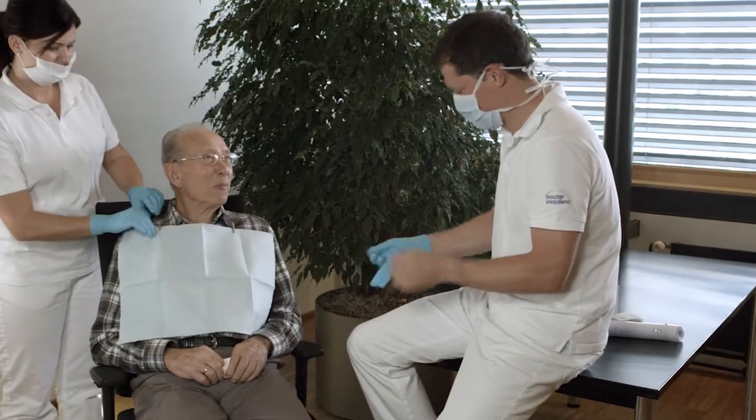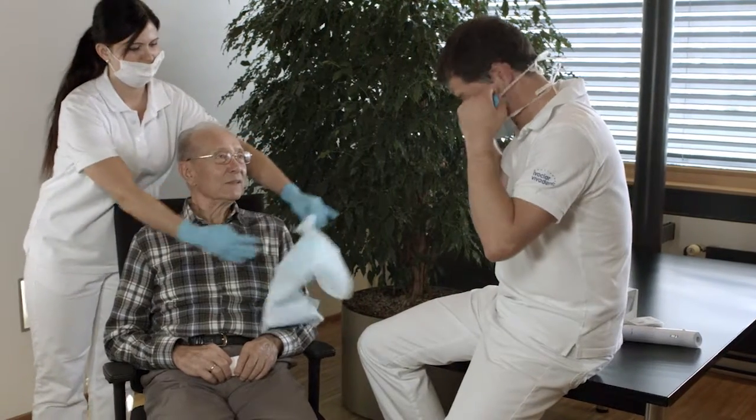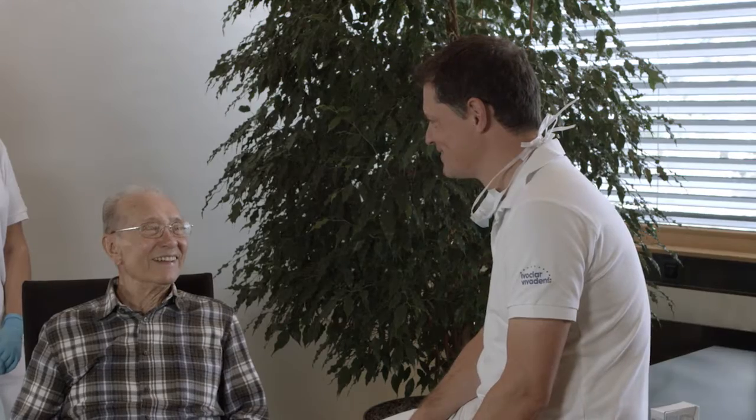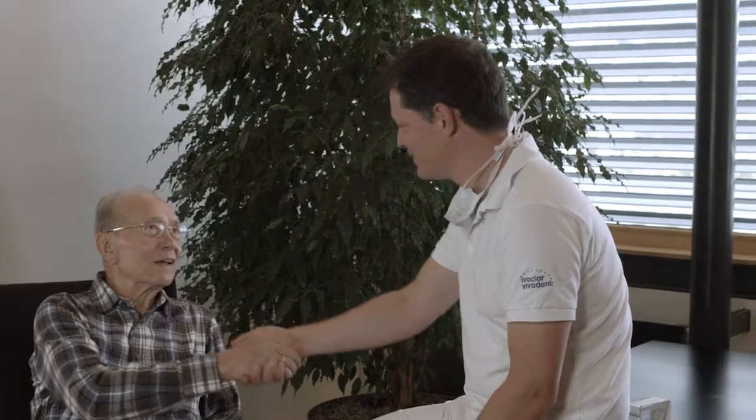Our tip: it is recommended not to eat or drink for one hour following the application of Servitec F. This enables the varnish to take the best possible effect. Generally, Servitec F is applied every three months. If required, it can be applied at shorter intervals.